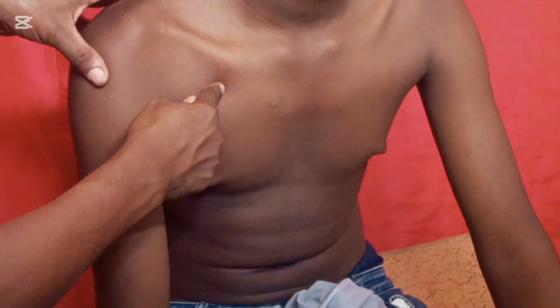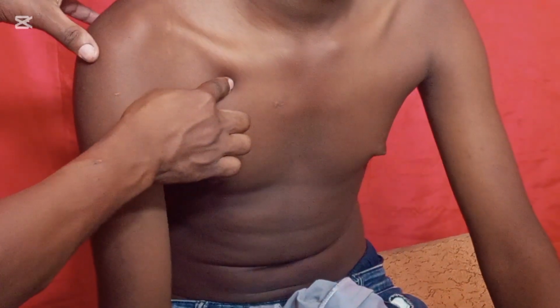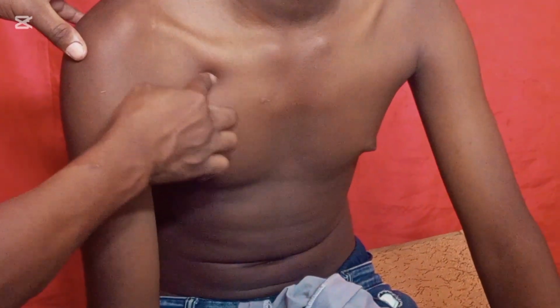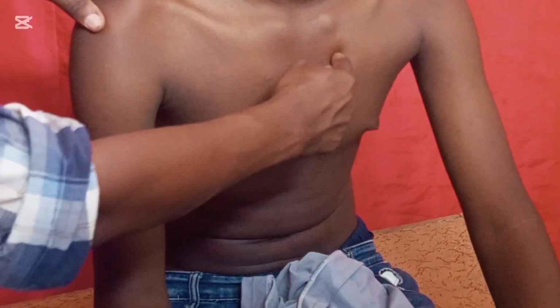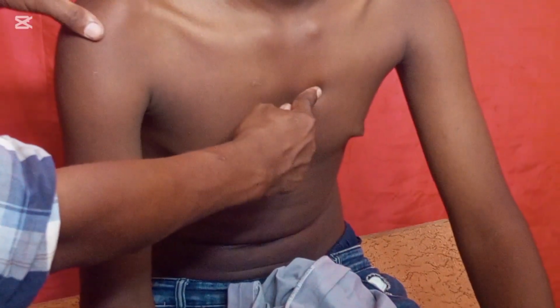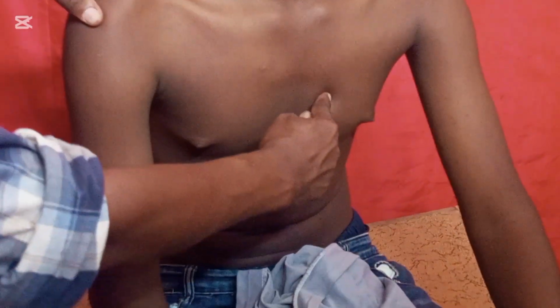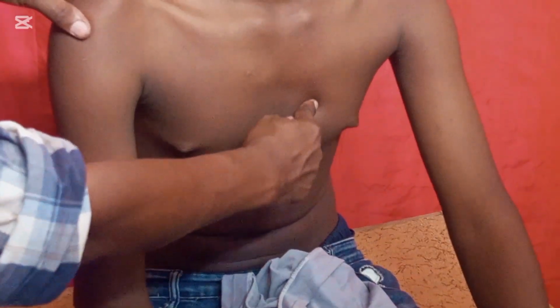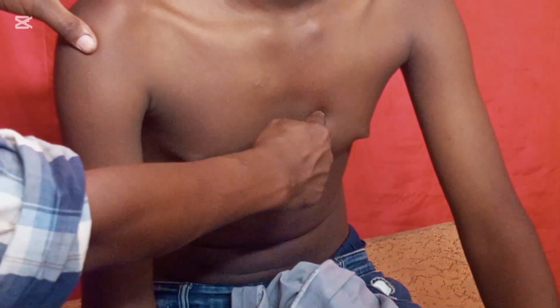Here is the second intercostal space on the right side of the sternum. Here is the aortic valve. Then we move directly into the second intercostal space on the left side of the sternum. Then we move to the third intercostal space on the left side of the sternum. Here is Erb's point. Then we move to the fourth intercostal space on the left side of the sternum. Here is the tricuspid valve.